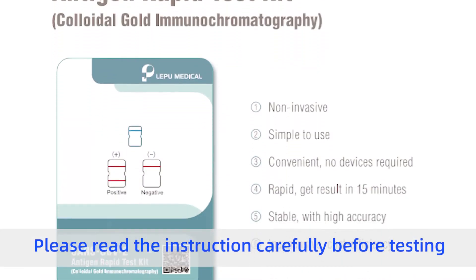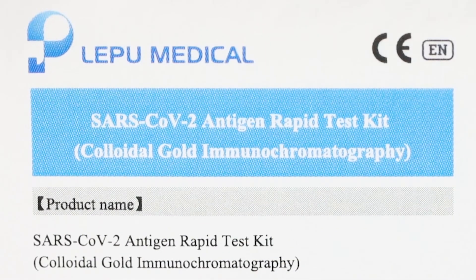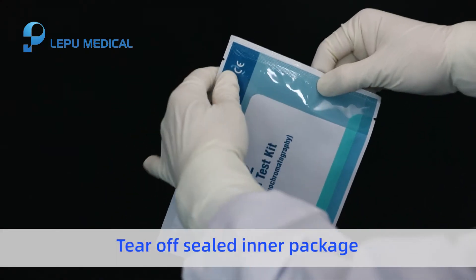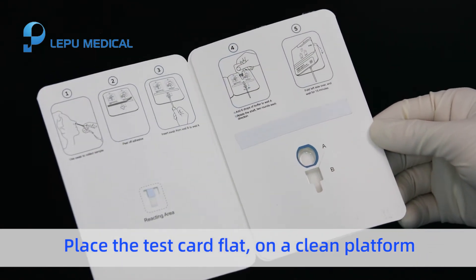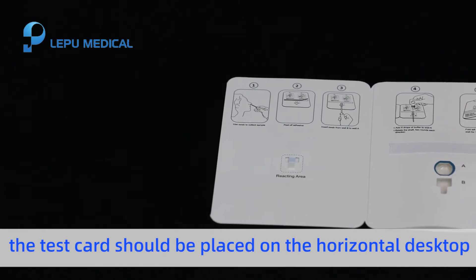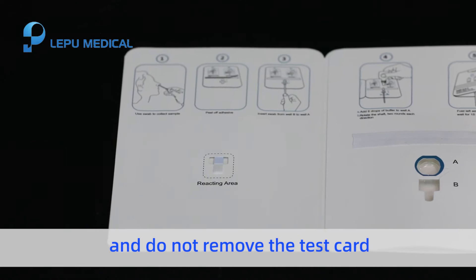Please read the instruction carefully before testing. Tear off the sealed inner package and take out the test card. Place the test card flat on a clean platform. During the test, the test card should be placed on a horizontal desktop and kept fixed. Do not remove the test card.